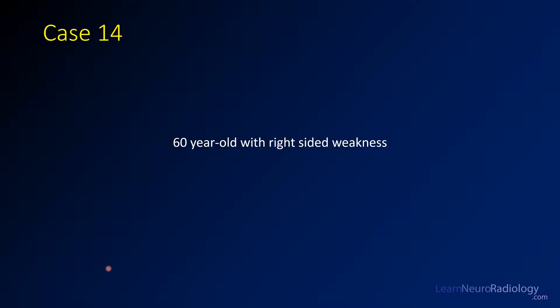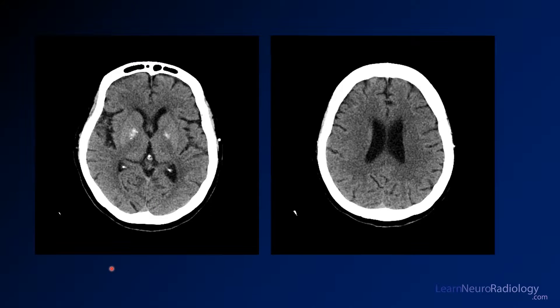For case 14, we have a 60-year-old with right-sided weakness, so we're moving on to images of the brain again. Here you see two images from a non-contrast CT. Take a quick look at those — that's usually the first study that a patient suspected of stroke is going to get.